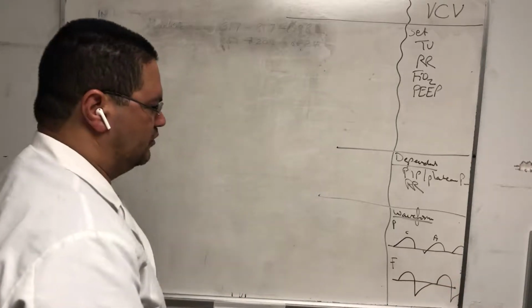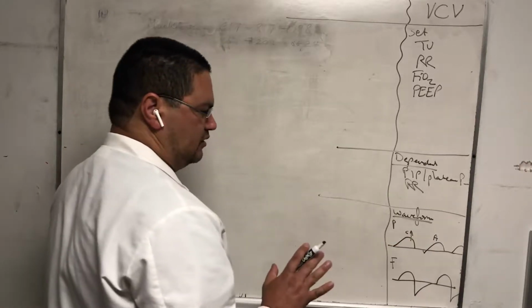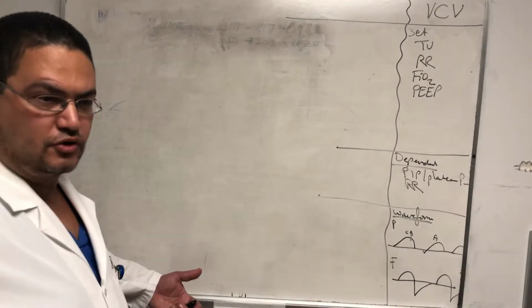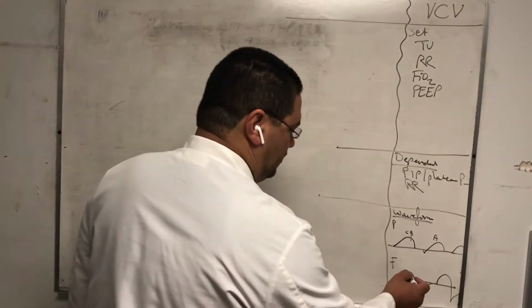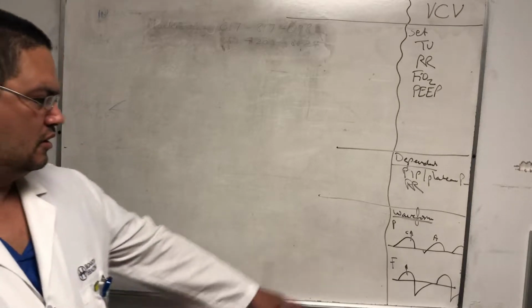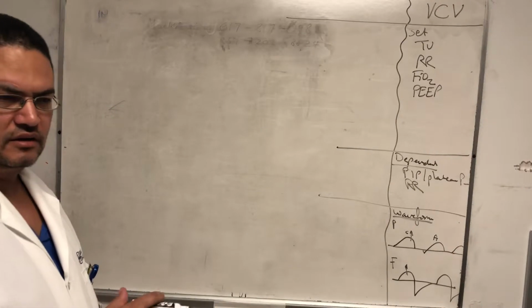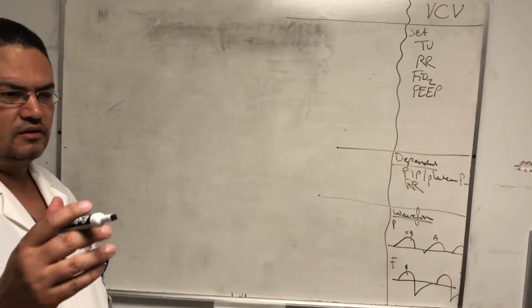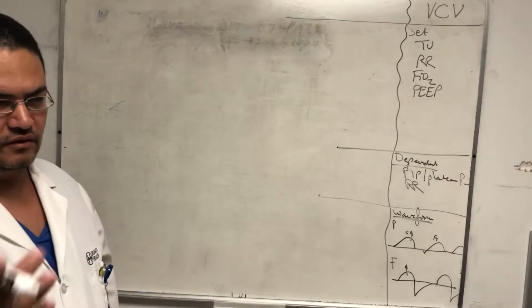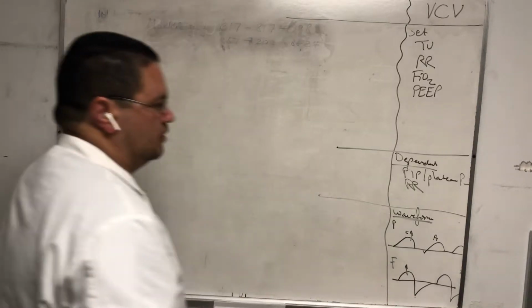As we talked before, the maximum pressure is reached towards the end of the breath because it's a volume delivered breath, so it keeps on giving the volume until the lung is completely full, and then the pressure is max. And the maximum flow is reached in the middle of the breath, and remember that when we compare it to pressure control. The flow accelerates until it reaches a max, and after it reaches the max, the lung is already half full, so the flow has to decelerate a little bit. And the exhalation always looks like this in all modes of ventilation.